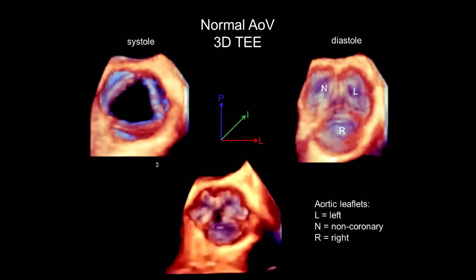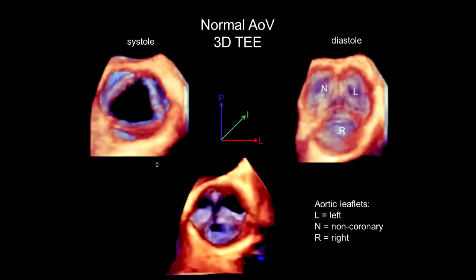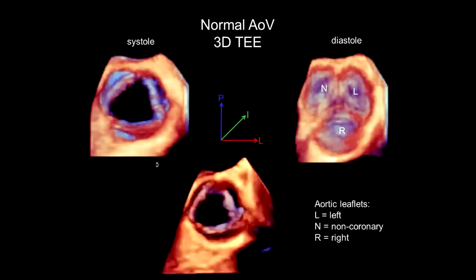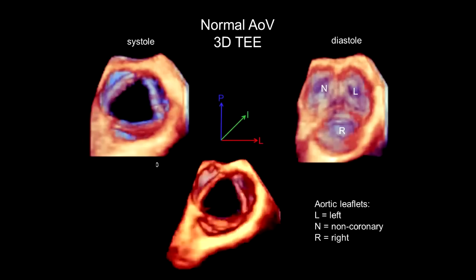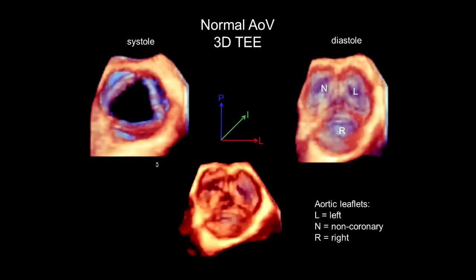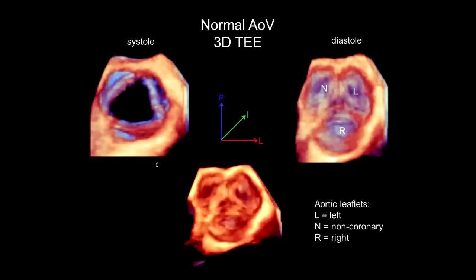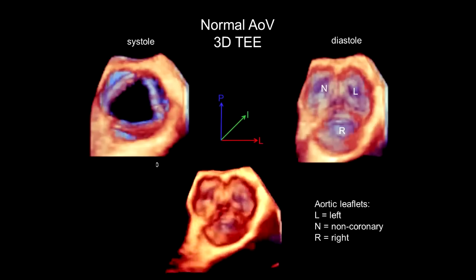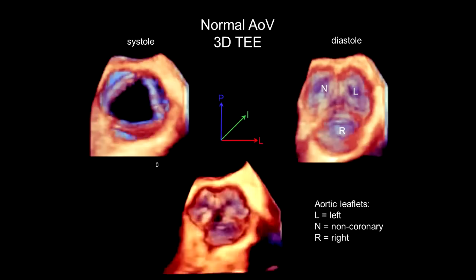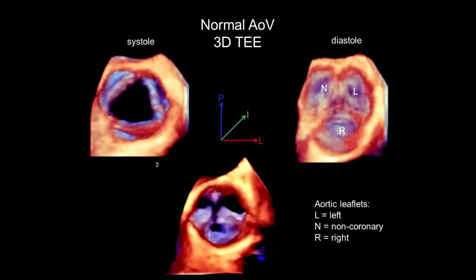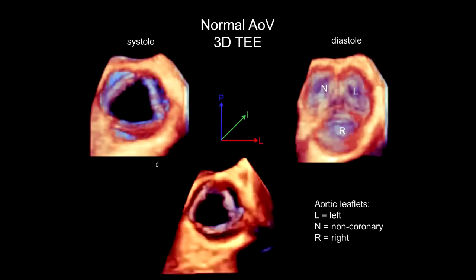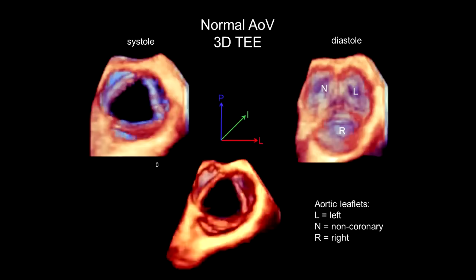Here's a nice example of a 3D TEE of an aortic valve — right off the machine with no post-processing. To get a picture like this with Live 3D, all you need is the mid-esophagus transesophageal view, dial in your aortic valve short axis 2D view between 30 and 60 degrees, optimize your 2D view, then launch Live 3D and adjust your sample volume size and position. You should be able to get beautiful views of the aortic valve like this, especially on 3D TEE.